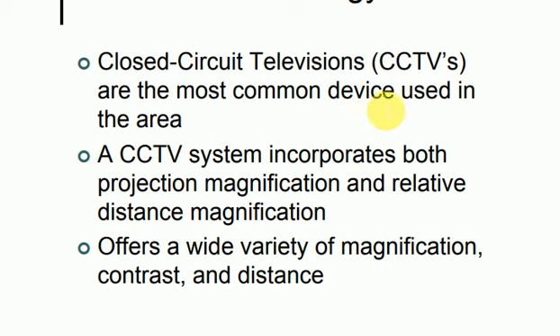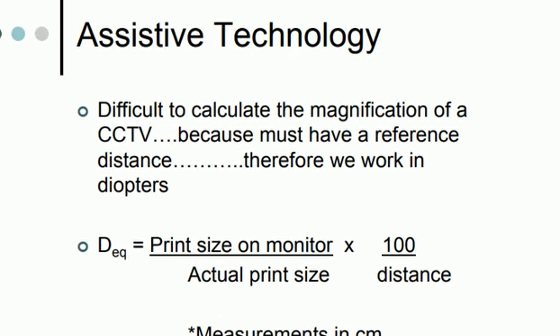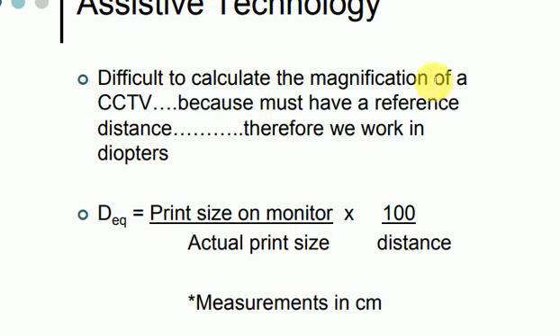CCTV is the most common device. It has both projection magnification, relative distance magnification, contrast, distance. But they are difficult to calculate the magnification because you must have a reference distance. Therefore, we work in diopters.